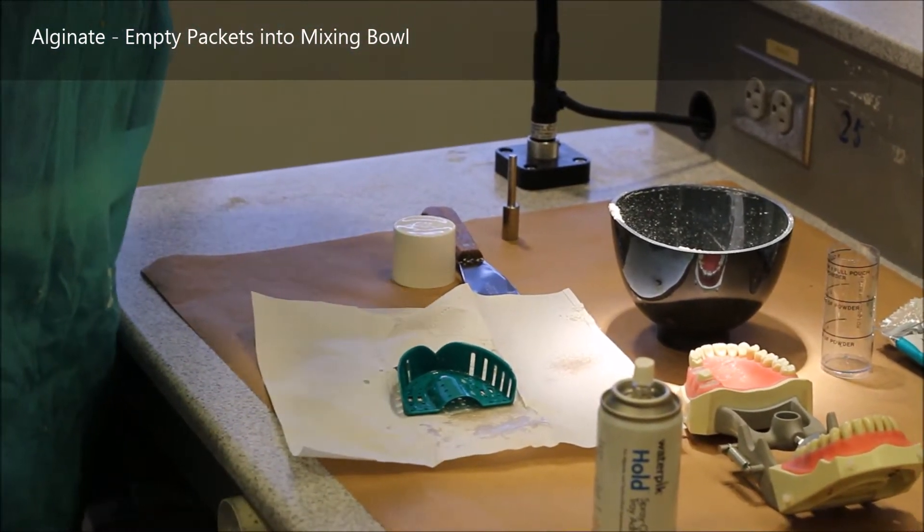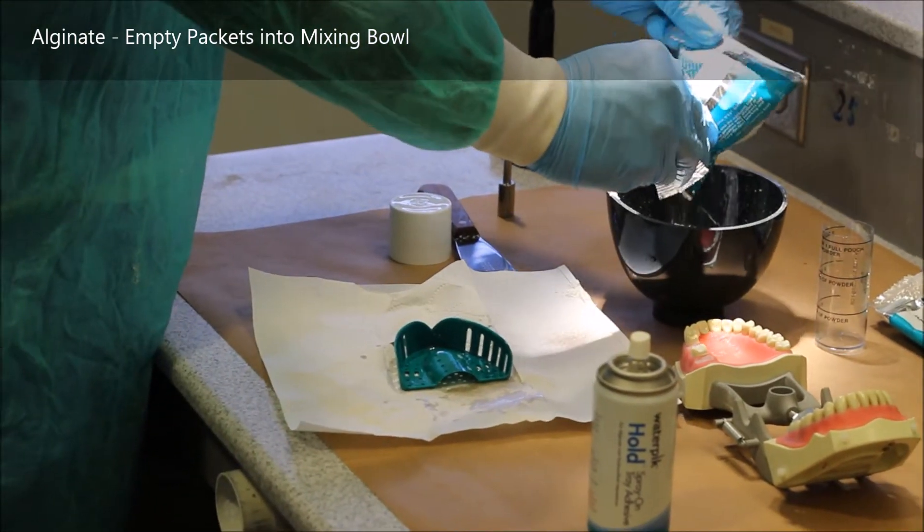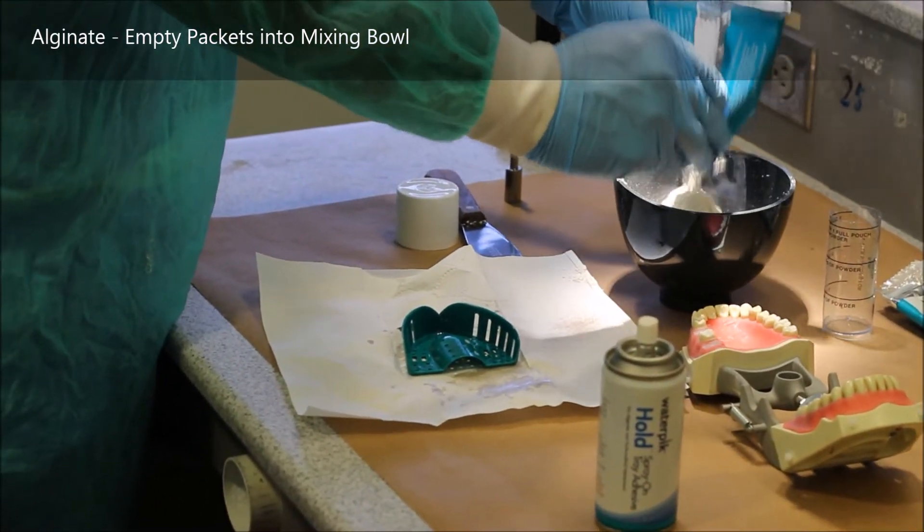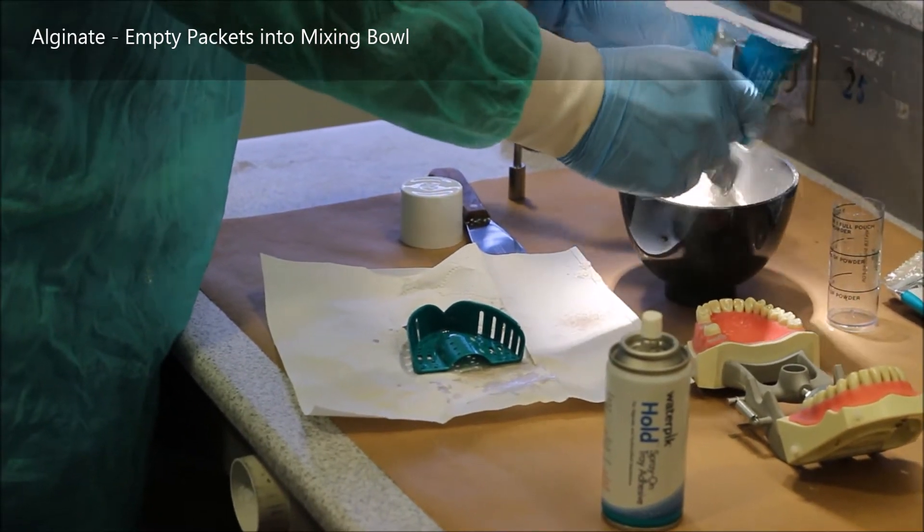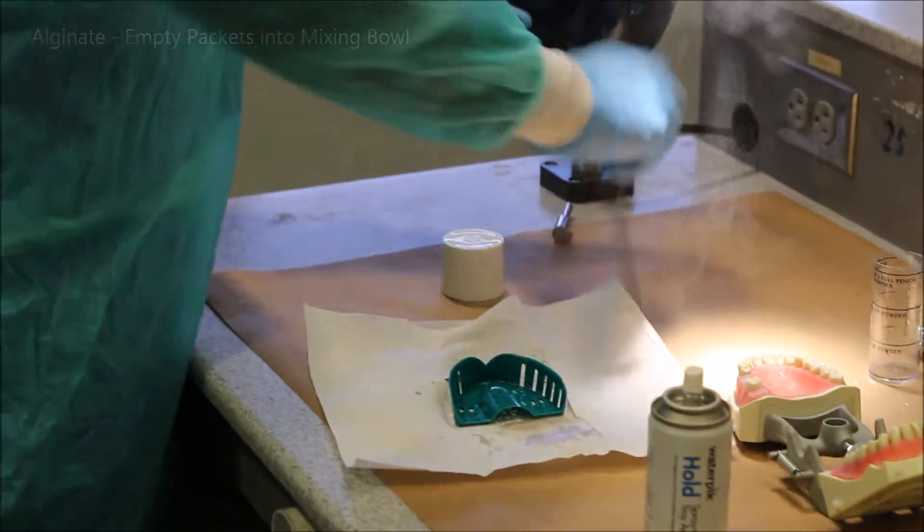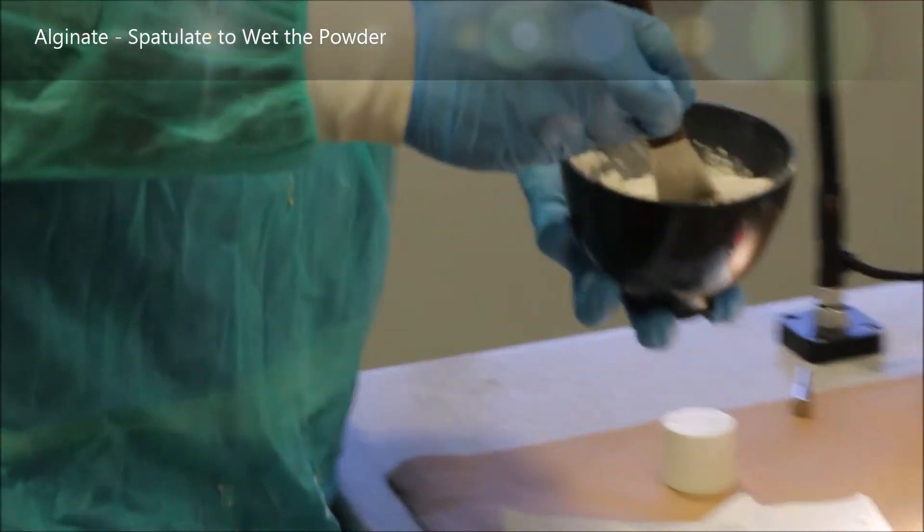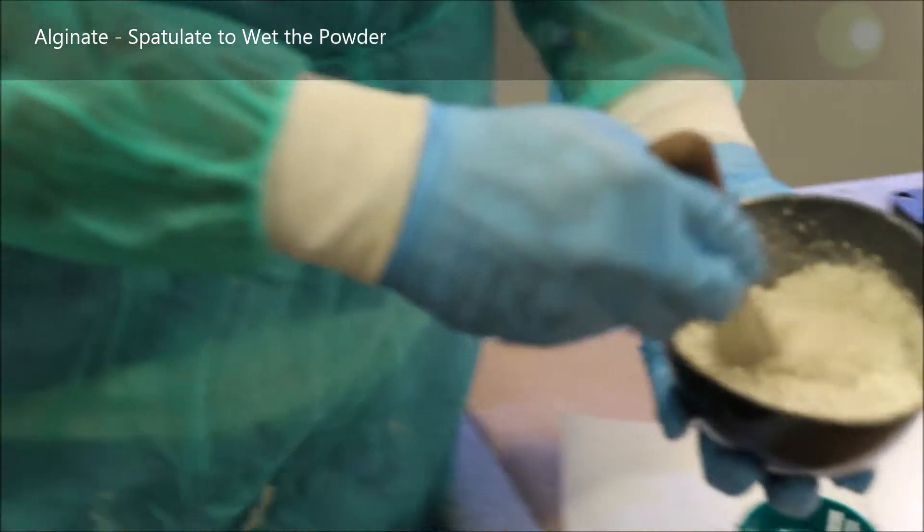The reason I'm using two here is because I'm trying to capture the typodont as clearly as possible. In this case, I'm trying to get all of the occlusal surfaces and all the teeth as well as the pink gingiva of the typodont all the way to its ends.